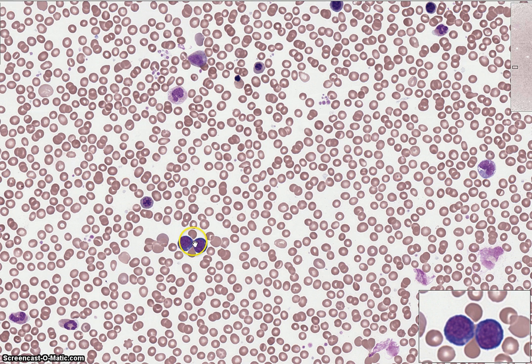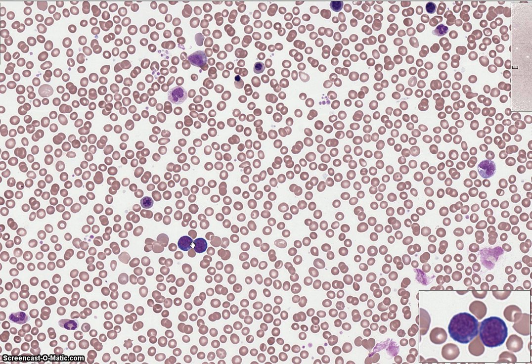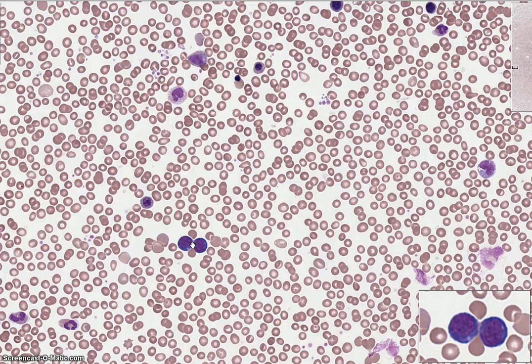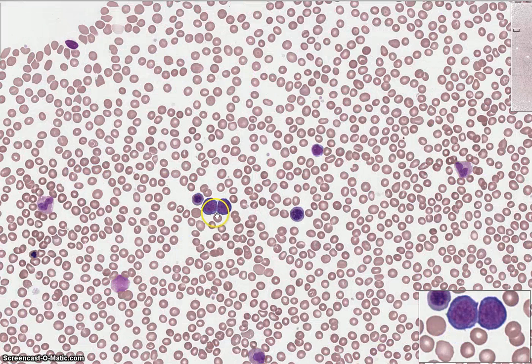Here I have two pronormoblasts next to my cursor. If you take a look at the bottom right hand corner of the screen you'll see a magnified view of where my cursor is hovering. Pronormoblasts are large cells compared to the surrounding mature red blood cells. The cytoplasm is a rich and dark blue, the cells are quite round as are the nuclei. There's fine chromatin in the nucleus, and nucleoli if present would be seen in this immature stage of development.